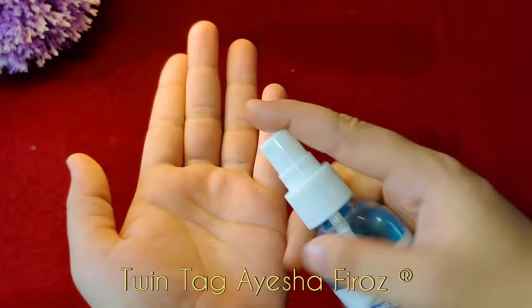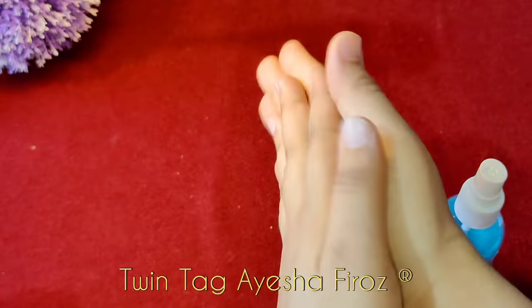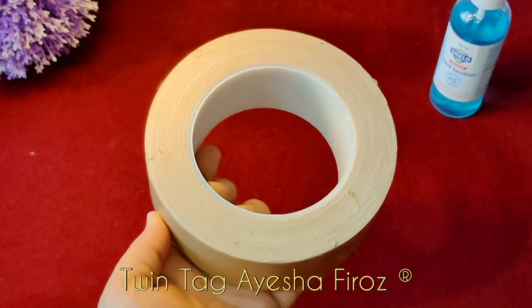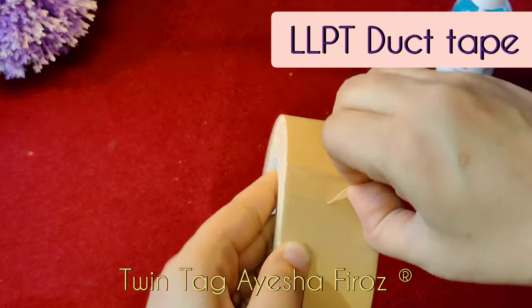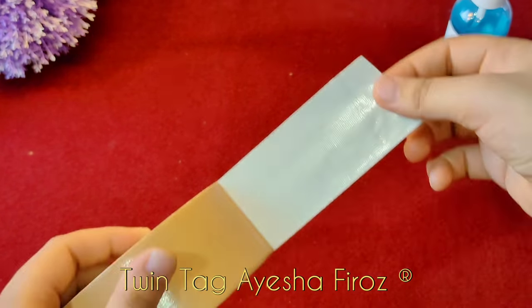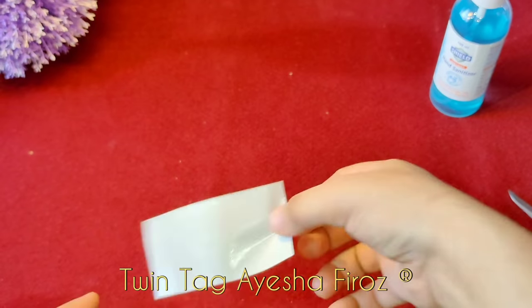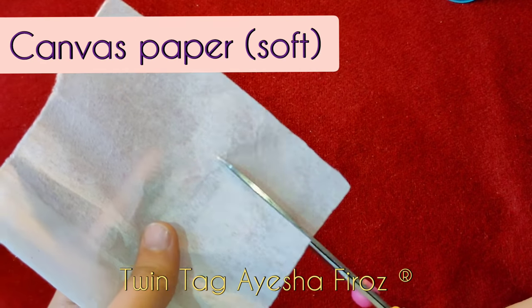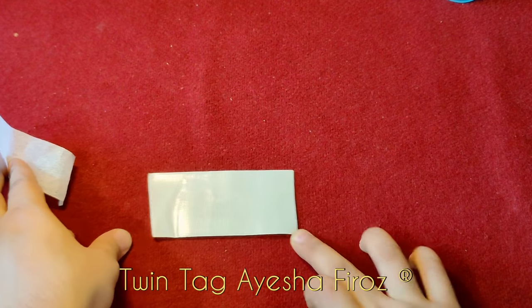Done with the sanitizing. Now I am going to take a duct tape — LLPT duct tape. Friends, if you have any type of tape you can use it. Then I am going to cut it. Now I am going to take it with canvas paper, which is very soft, it is not hard.